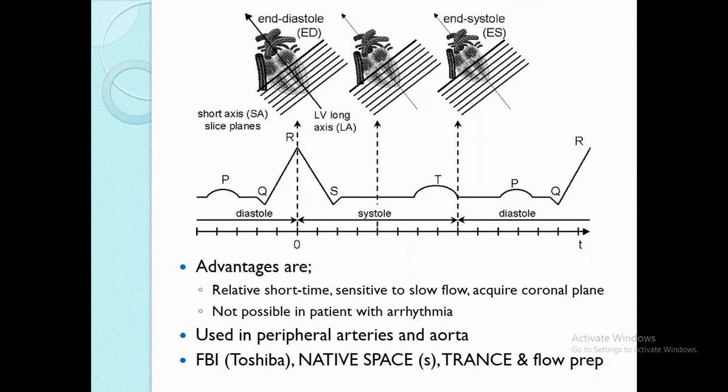So that's why it's very, very important. Okay, the area between the S and T is the systole. The systole actually happens here, but it finishes there. That's why we call it the end diastole, end systole area.